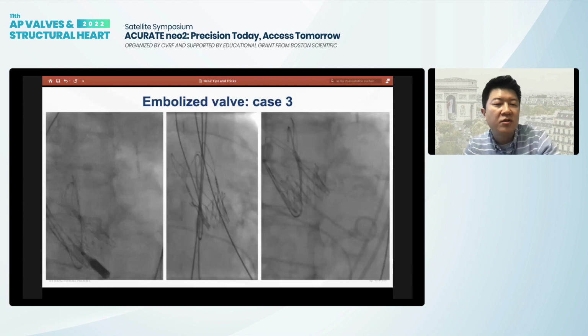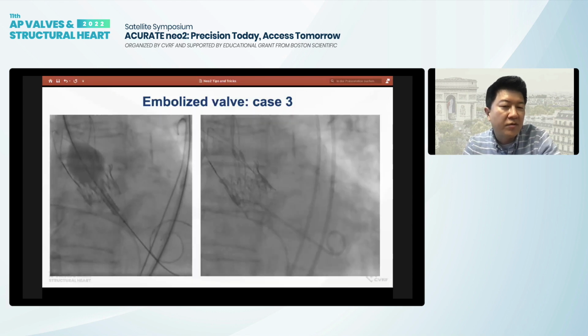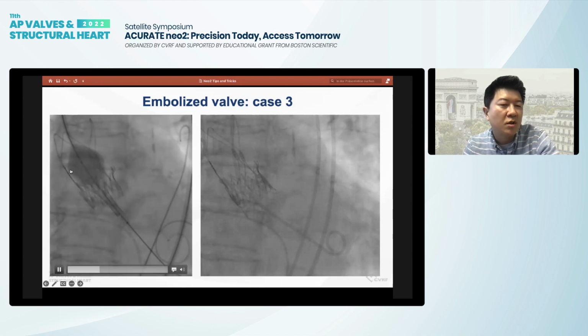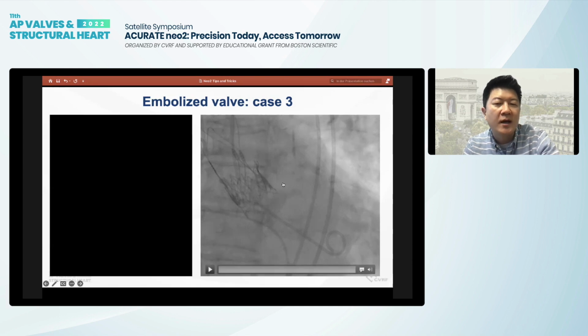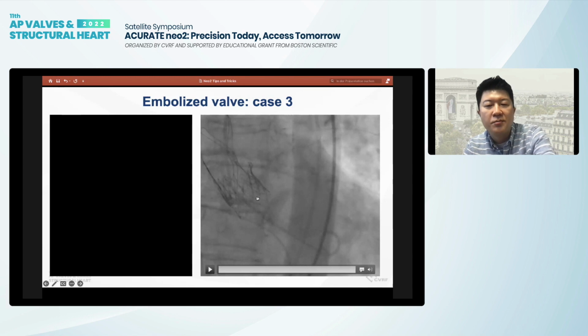We've done it in a series of patients. So this is a bare metal stent that we have in stock, and the theory behind it is that we would not cover the leaflets. We have the functional leaflets and have anchored the valve, and there's no PVL.